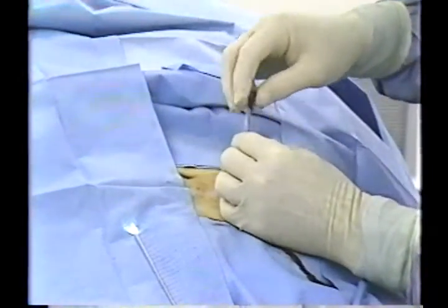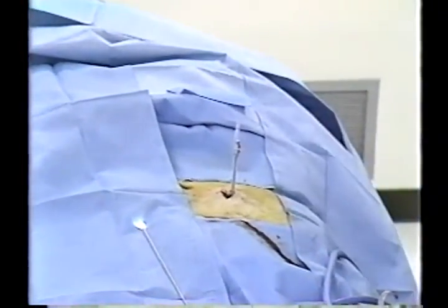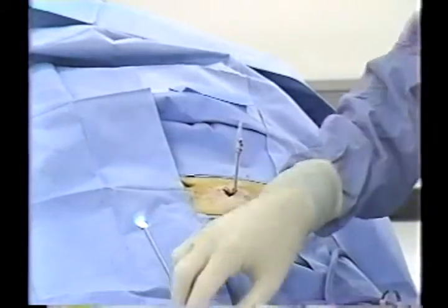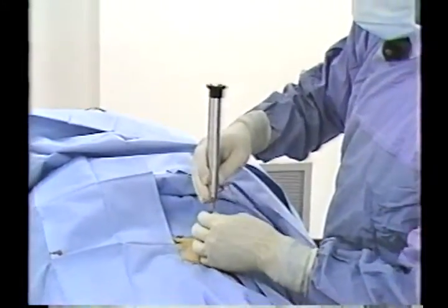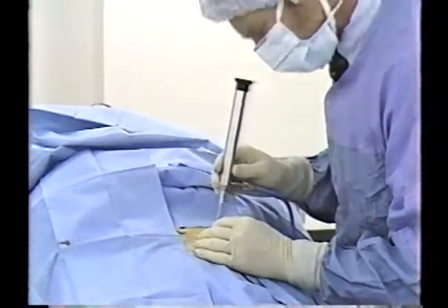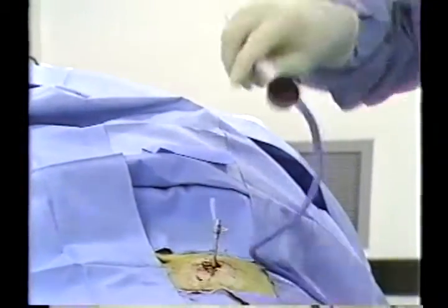After the initial insertion, the sharp trocar is removed, leaving the cannula and quill catheter guide in the initial entry position. The needle scope is inserted into the cannula and the luer lock is tightened. The local peritoneal surface may be easily inspected. The presence of highly reflective, vessel-covered surfaces which move during respiration indicates the correct intraperitoneal position of the cannula.